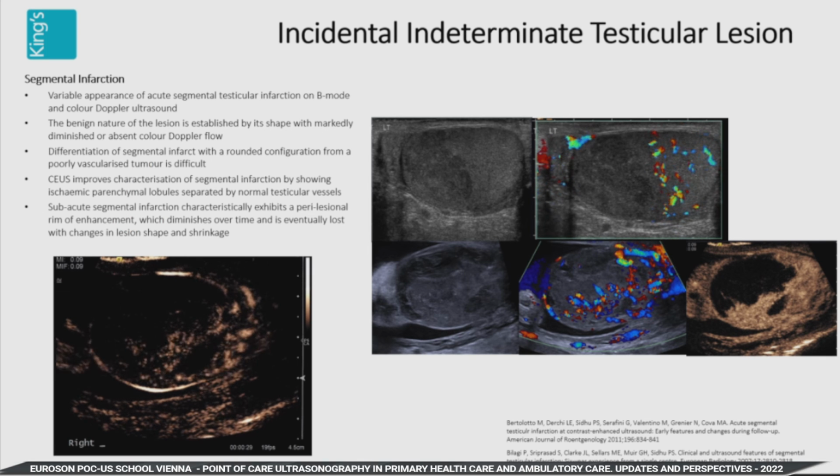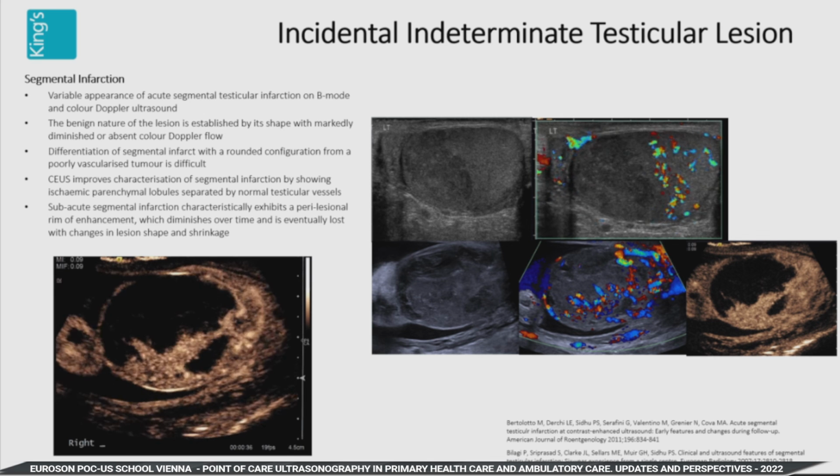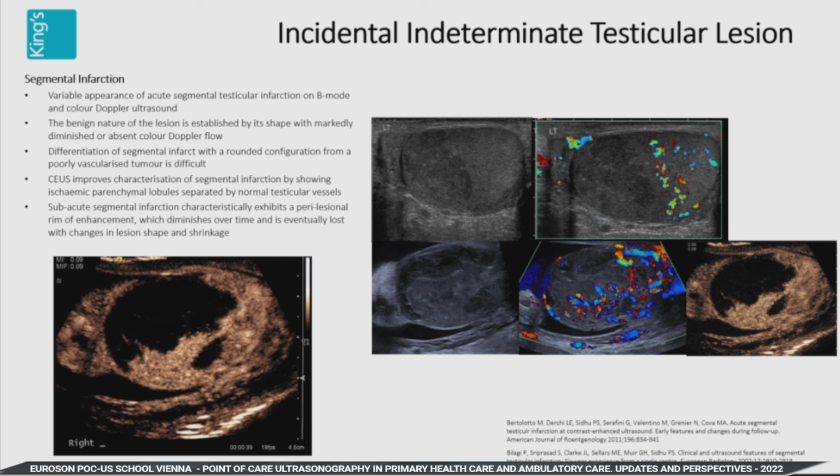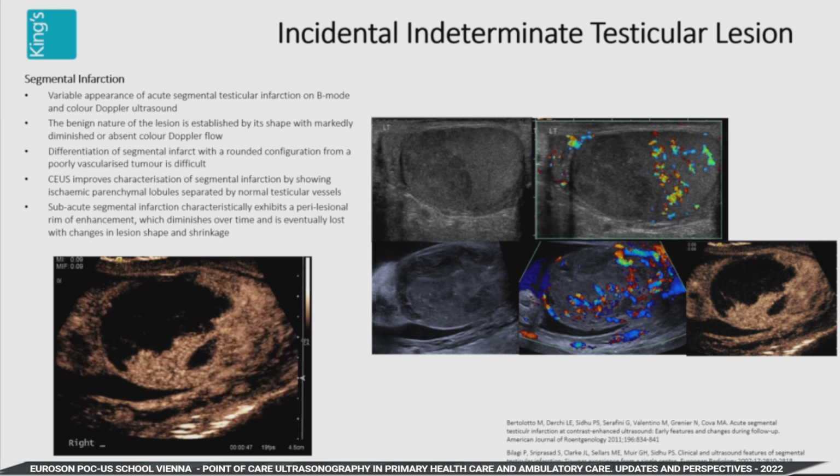And you can see how, using that contrast, you immediately see which areas of the testes are viable and which have got no flow at all. This is what you call in basketball a slam dunk. There's no doubt that this is black and white, day and night. So it's a very useful tool to tell you that there's no vascularity at all.